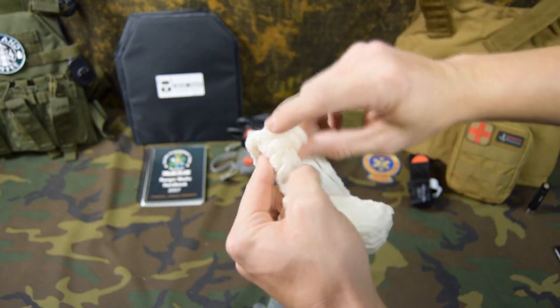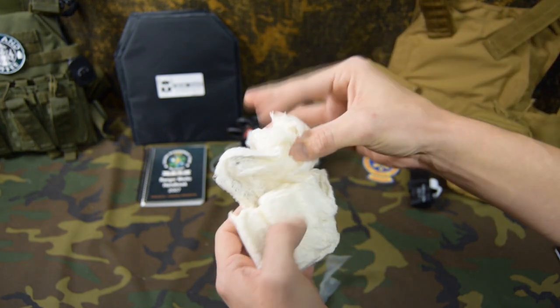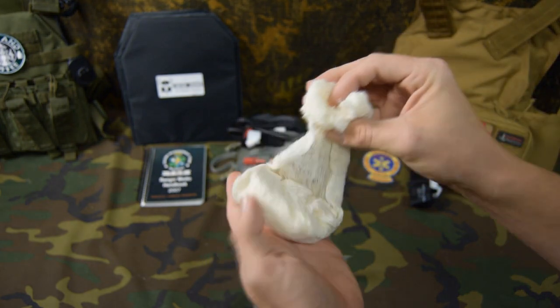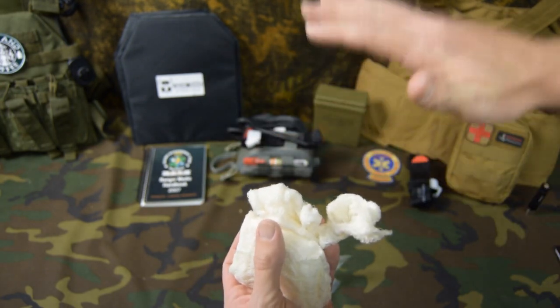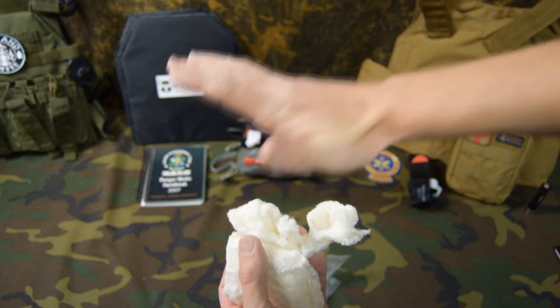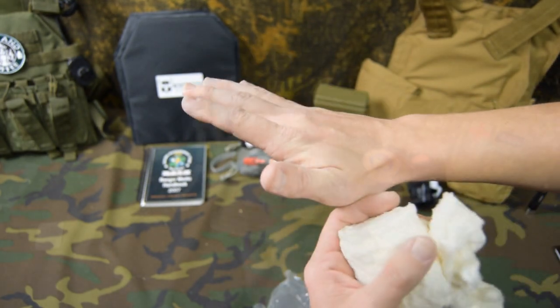Once I pack that in there, this finger would come over and go to that pulse of the finger. Then I can pull some more with this finger, put it back, and then put it back. And then you're going to pack the entire wound until it is tight and overflowing with gauze. Make a little mound with the gauze, then you can take your hand, push down with a lot of body weight, and you're going to hold pressure there.